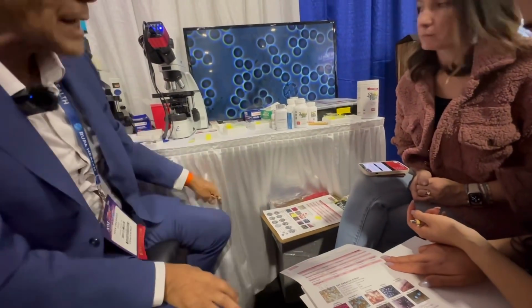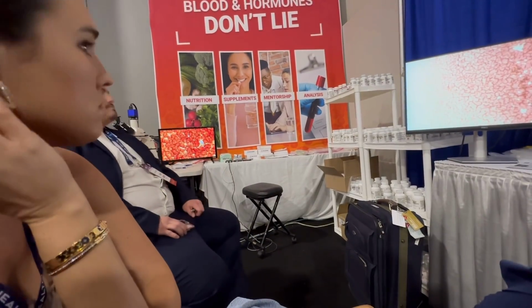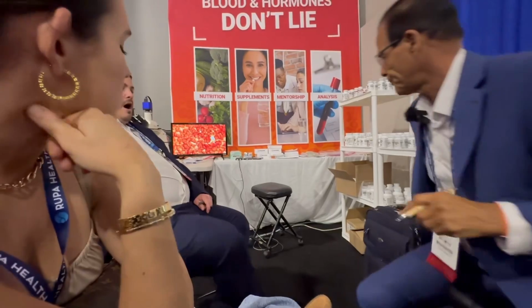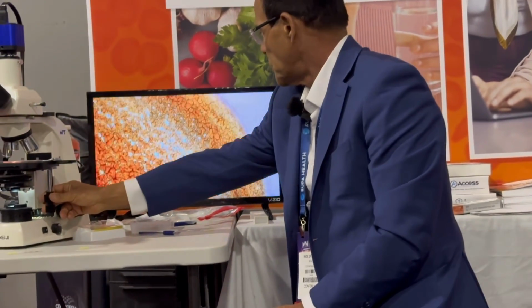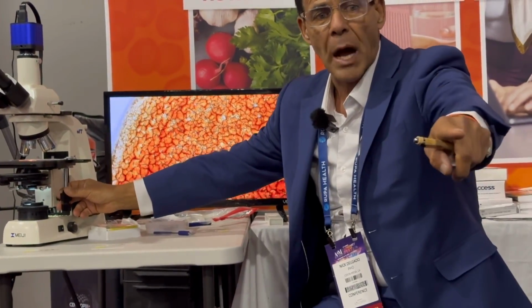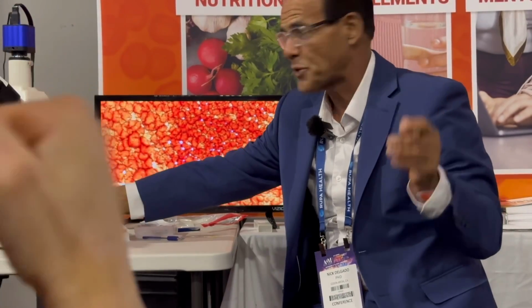Now on your dry blood, we're going to compare it to Stefan, and you see that hole right there in the middle, that big hole. So healthy blood should look like this, no holes, right? So then we look at each drop. It starts with the big drop. You see where I wrote on the form. And if there's any holes, you're going to put a percentage.